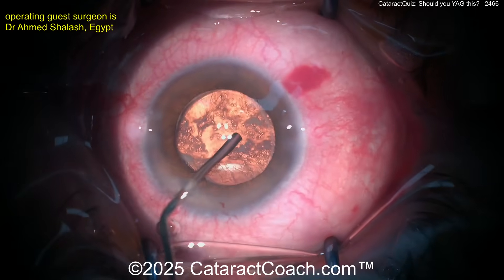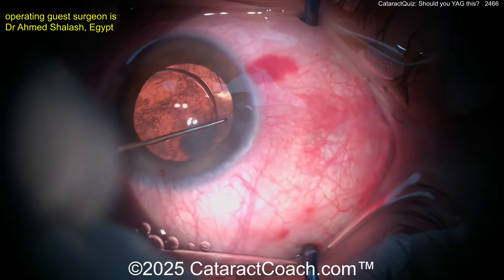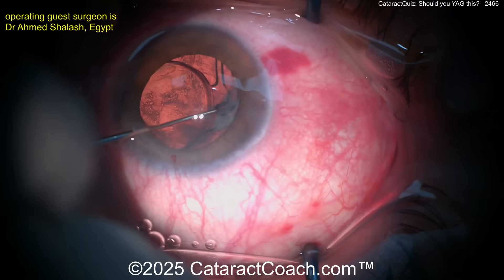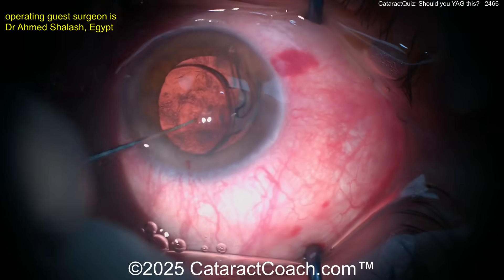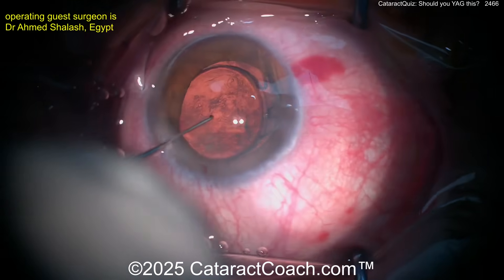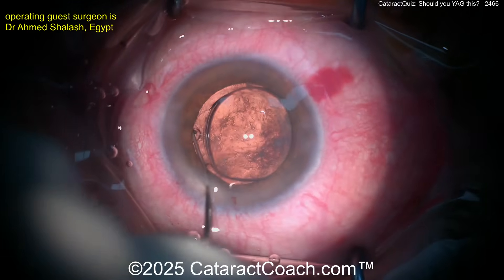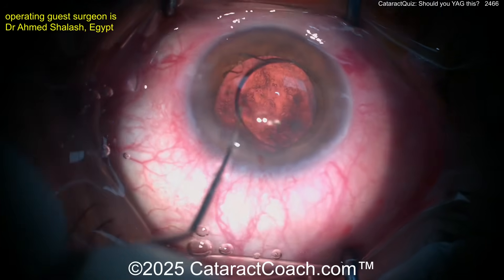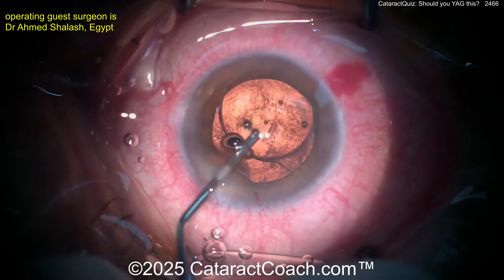Why don't we lift the lens up a little bit more? Very interesting case here — it looks like proliferation of a lot of these lens epithelial cells. Getting the IOL carefully up out of the capsular bag to give yourself some room. You may not need to lift up both haptics, but there's one haptic up, and here's the other one. Now you've got the entire IOL sitting on top — you've got some room behind there to maneuver.